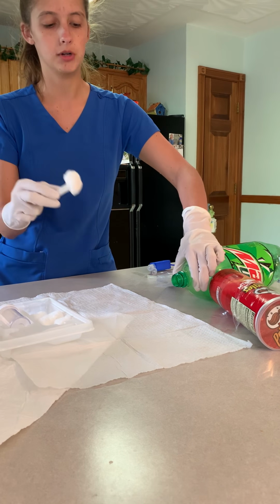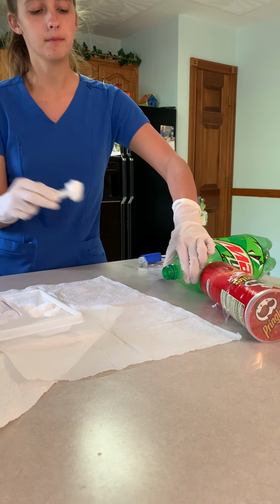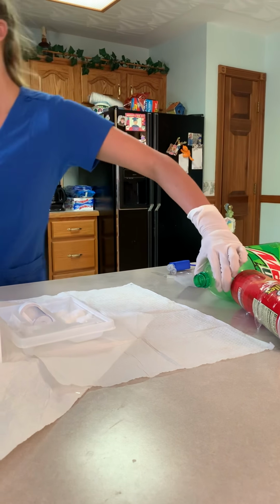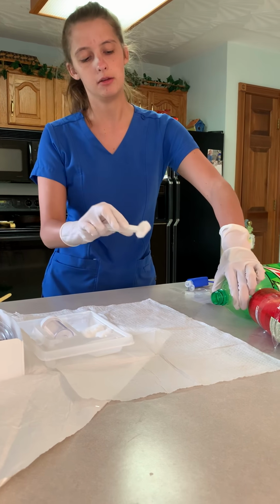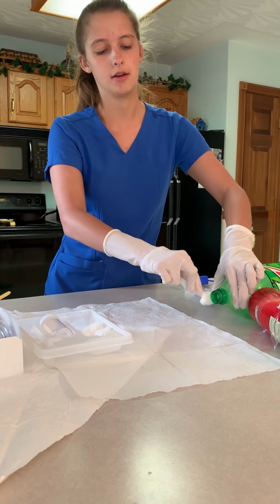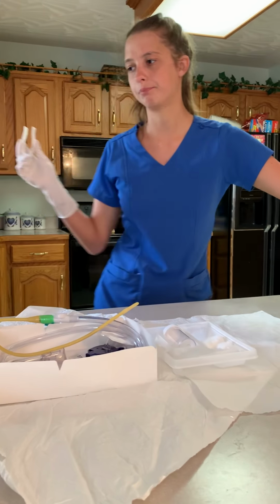with our cotton ball covered in betadine. We're going to go in a circular motion. We're going to go that way. Then now we're going to pull back and throw it. Okay, and next we're going to go up around the urethral meatus at the top, a little at the head of the penis. Okay, and then we're going to go out and away.